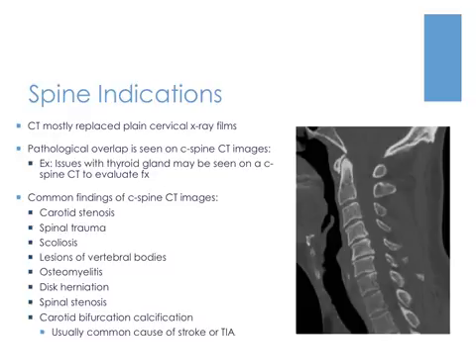A certain type of pathological overlap is seen in the cervical region on CT imaging because conditions affecting the vessels, bones, and soft tissue are often found when one type of cervical exam is done. For example, a patient may be having a CTA exam of the neck performed, but abnormalities with other body parts can be found on the CT as well, like possibly with the thyroid gland, neck muscles, or another type of anatomy.